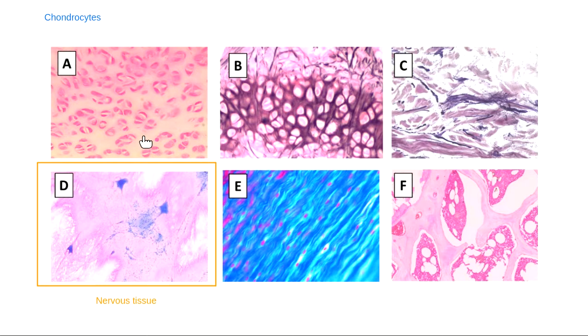Which of the specific types of cartilage do we see here, by the way? What's the name of this one? Yeah, this is my hyaline cartilage. Hyaline cartilage. So again, hyaline cartilage is the one that I want you to think about, like I said, kind of like deer tracks in the snow. So my groups of chondrocytes that are surrounded by light pink, that's hyaline cartilage.